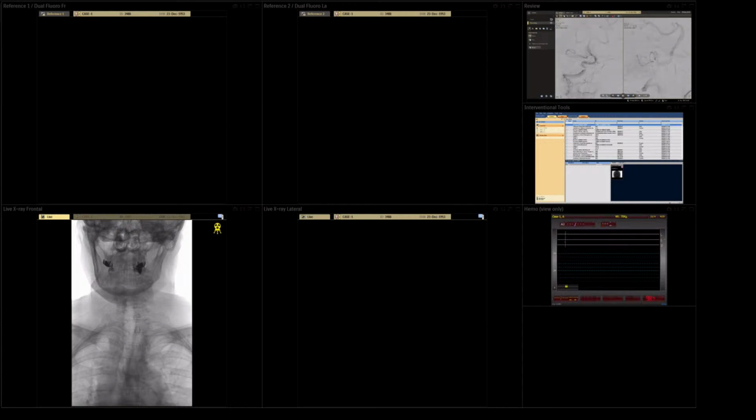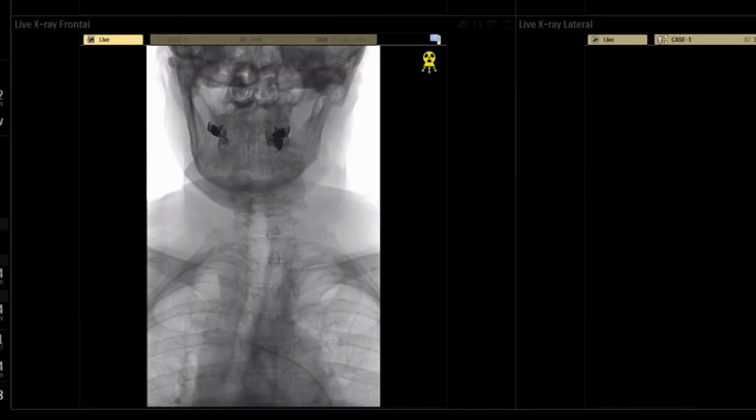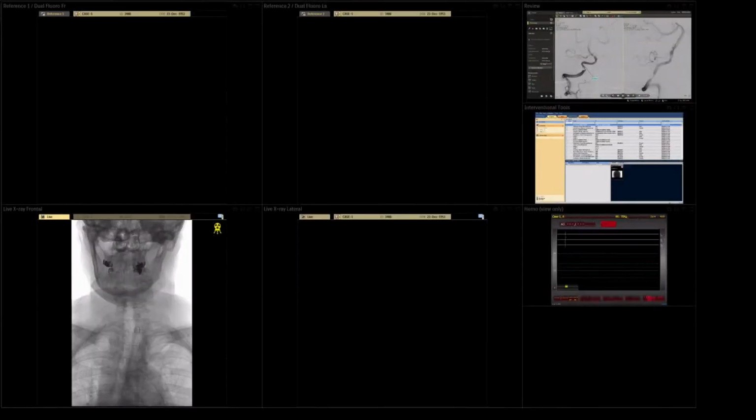Yes, on CT angiography, basilar artery was also stenotic, and it's a proximal basilar, and let's see, this artery is nearly 2 millimeter, 2.3, and this segment is nearly 3 millimeters, 3.2.